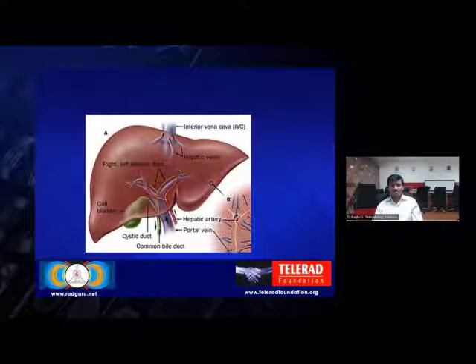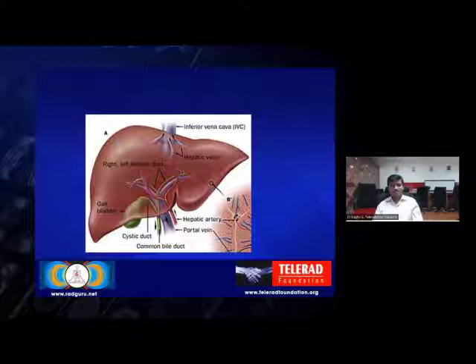With the gross anatomy, you can see that the inferior vena cava is posterior and the gallbladder fossa is anterior, and superiorly it's a dome-shaped surface. Inferiorly you have the porta hepatis with three main structures: the portal vein, hepatic artery, and the bile duct coursing through.